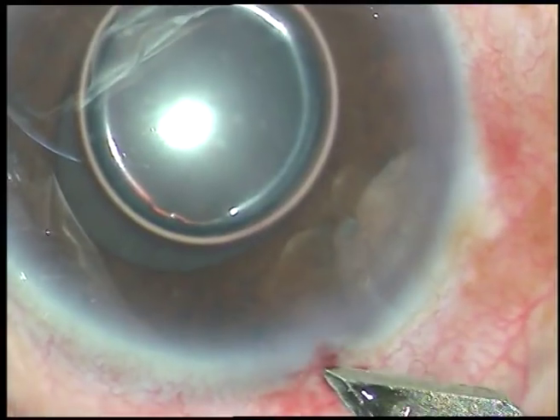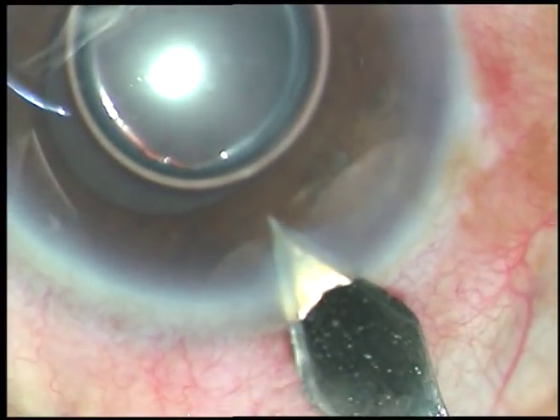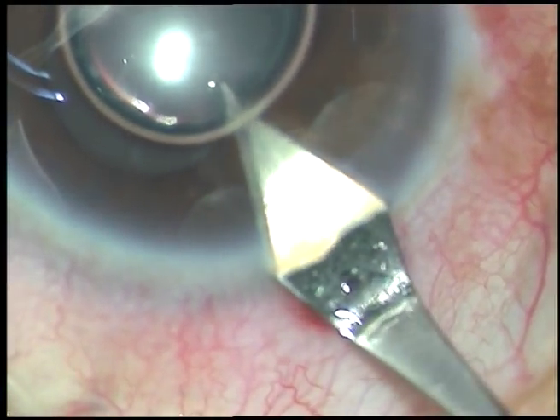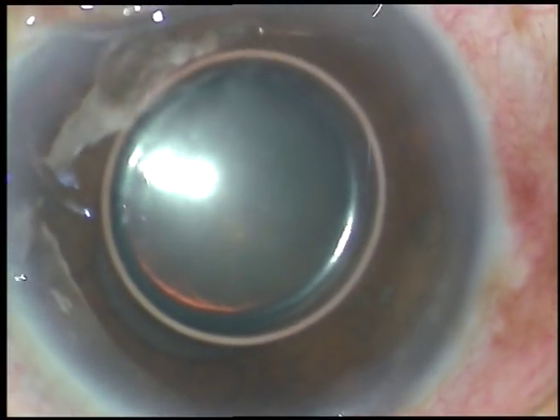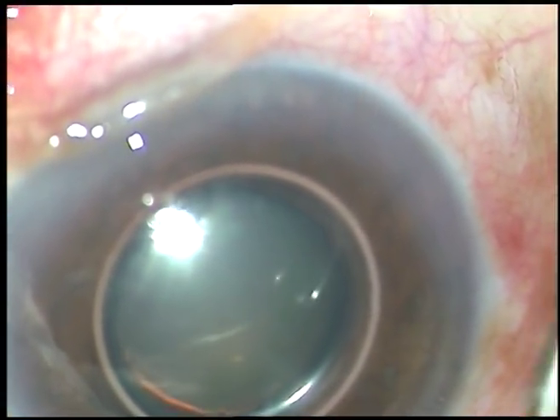Now I enlarge the small incision to 2.8 mm. Now I inject viscoelastic substance.